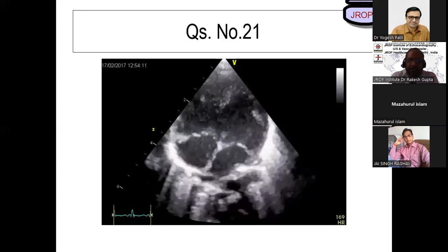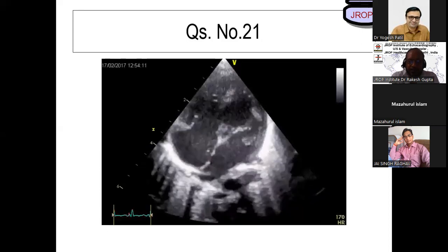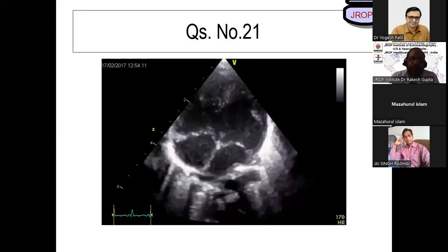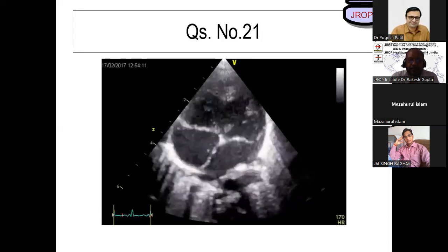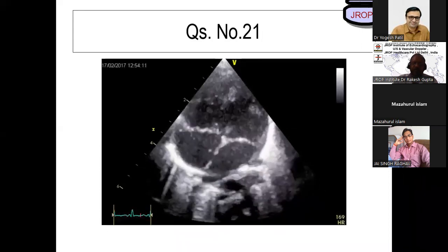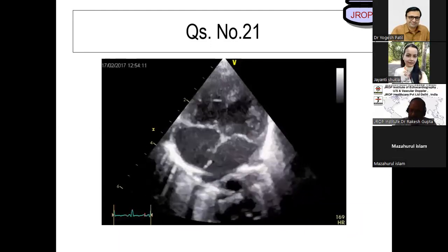What do you say, inlet? Yes. Aorta is not seen, sir. Correct. Large muscular inlet VSD occupying the basal and mid part of the muscular septum. Correct? Yes, sir. And those two chambers are behaving like a single chamber. What else apart from this? Look carefully. Valves are okay, man. Sir, a small atrial septal defect is also there, sir.